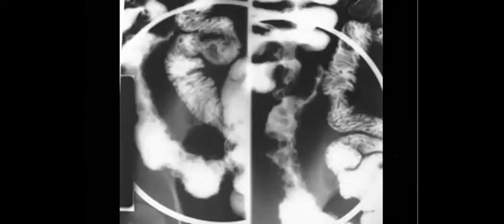Crohn's, cobblestone. Crohn's with skip lesions. Yes, I think it is cobblestone.